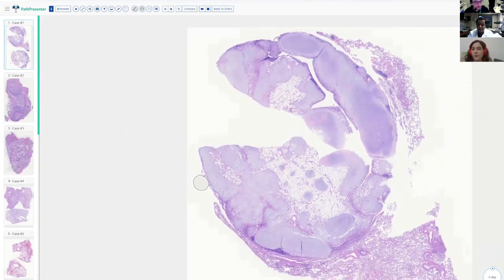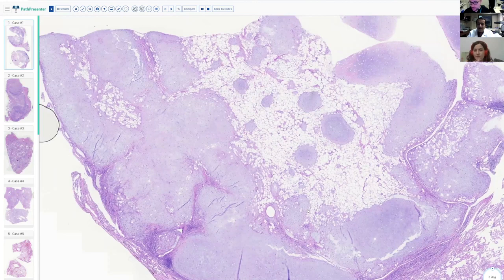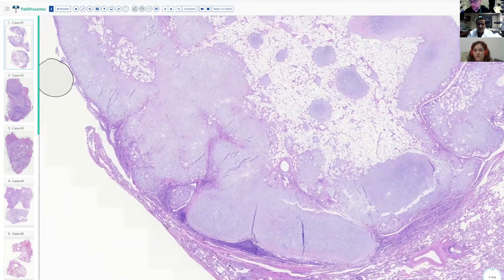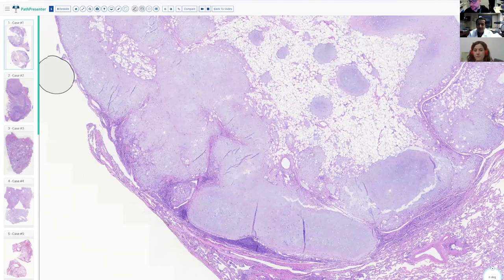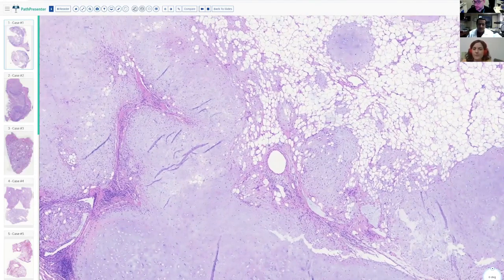Anything you want to add for this, guys? Have you had cases where there is no cartilage, or no fat tissue? I mean, only the fibrous tissue and the bronchial epithelium? Yeah, I've had some where the components are relatively less. If it's just cartilage, you start worrying about something like a chondroma. No, I mean without cartilage. Oh, without cartilage, just the fat? Like an adenofibroma, only the fibrous stroma and the bronchial epithelium. I haven't had a case like that. Sanjay, have you? No, I haven't either.